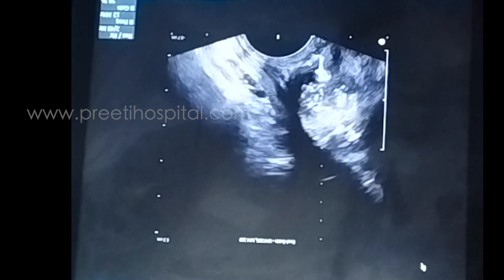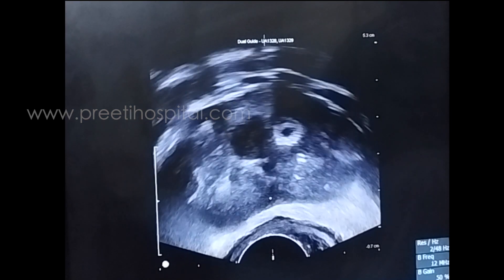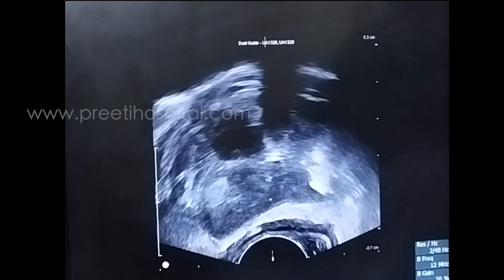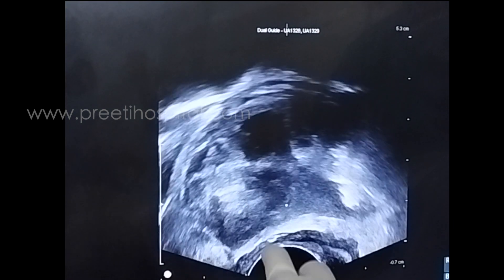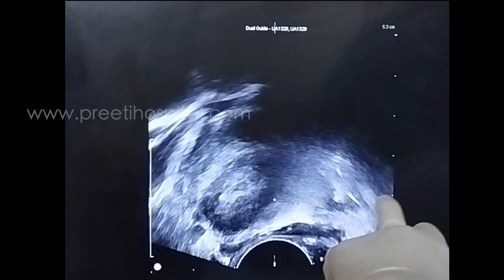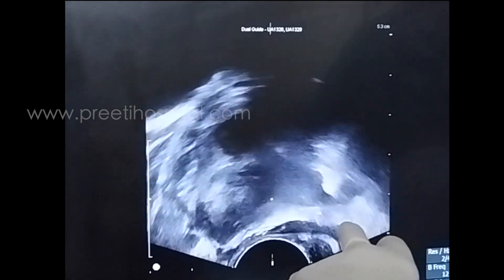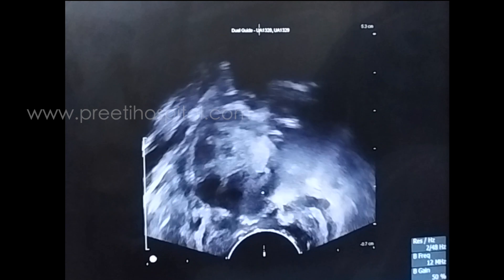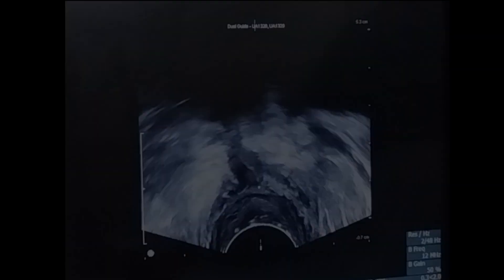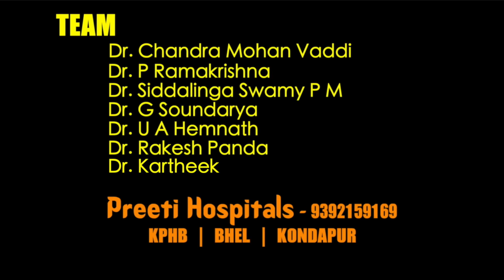When multiple abscesses are present, we do not want to blame any other cause except the prostatic abscess. You can see multiple abscesses so nicely seen on this transrectal ultrasound with high frequency. The pro-guide is present and directly drains the abscess. All this pus drainage is very important — antibiotics alone may not help in this patient.